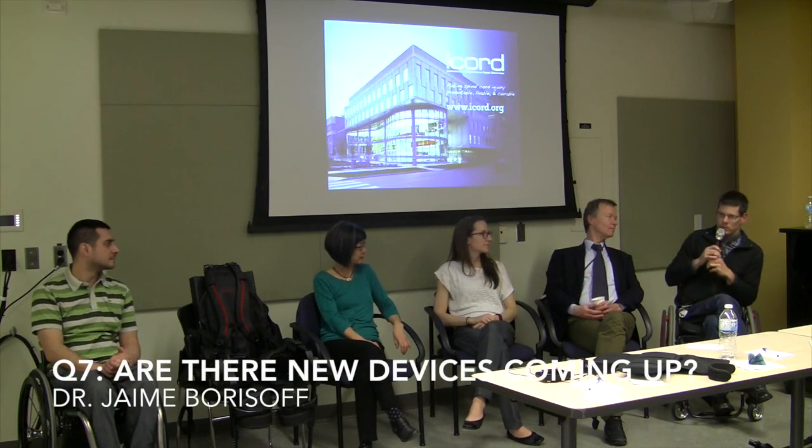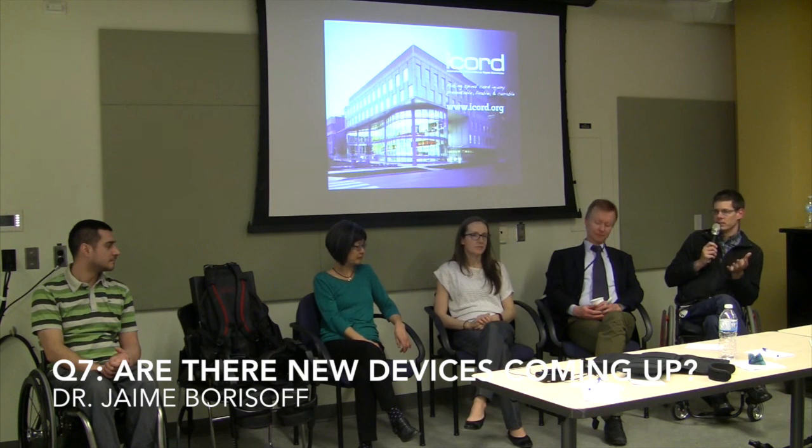And then the other one I mentioned, the $40,000 version, is called Suit X. Again, there's very little known about it right now. It's going to be cheaper. It's also going to be lighter. It doesn't have knee motors, actually, so it's using a different strategy to reduce some of the mechanical complexity and make it a little sleeker. That means it probably won't have as natural a gait. It would be more designed for just walking as opposed to, say, neural retraining of motor function and gait function.